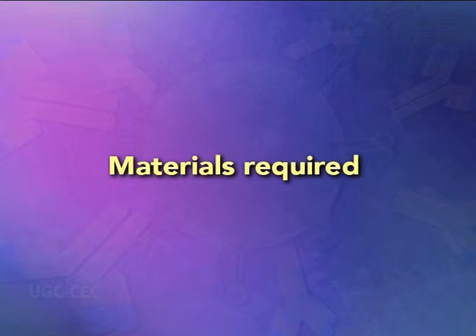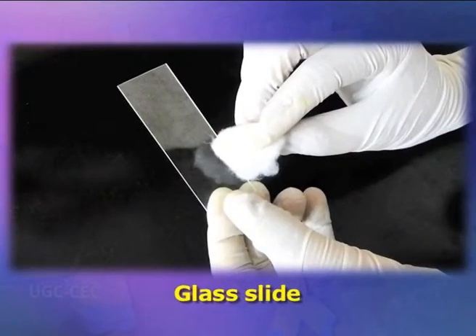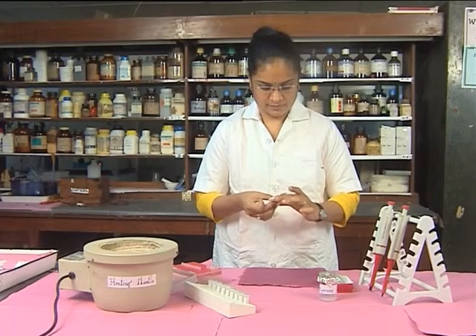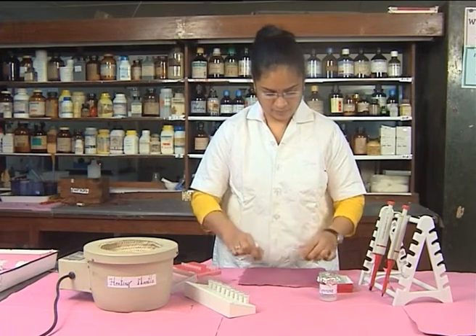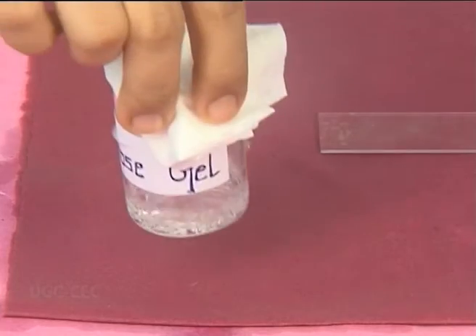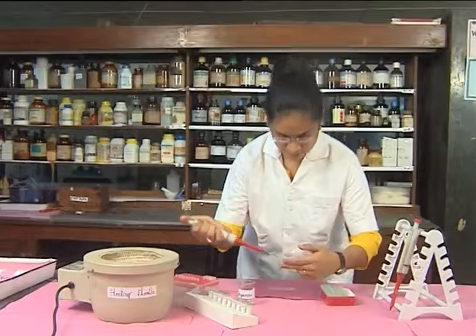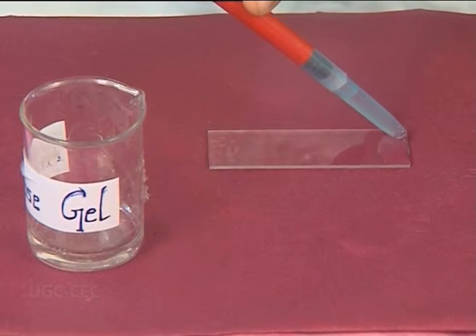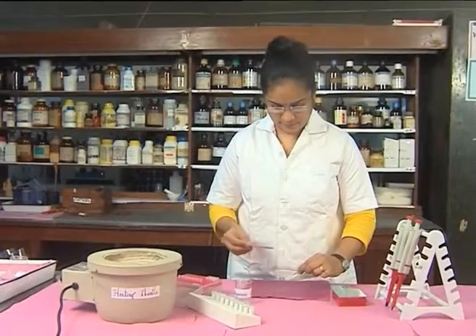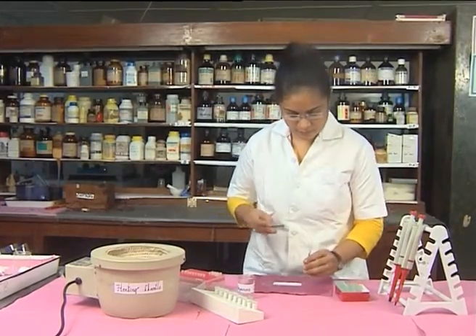Materials required to perform the practical include 1.2% agarose gel, sample antigens and antiserum, a glass slide and cup borer. Step one: wash the glass slide properly with detergent to make it grease-free. Step two: prepare the agarose gel, cool the agarose solution to 55–60 degrees Celsius, and pour 4 ml of agarose over the grease-free slide. Step three: using the cup borer, punch the wells by keeping the glass plate on the template showing the pattern of the wells.